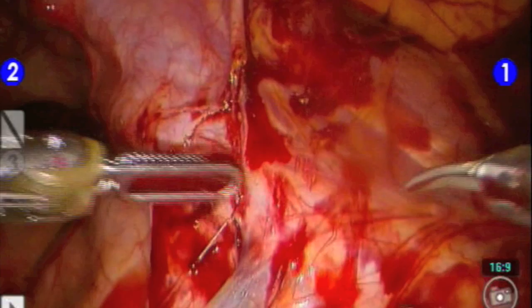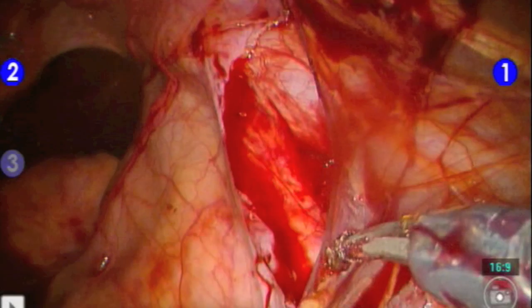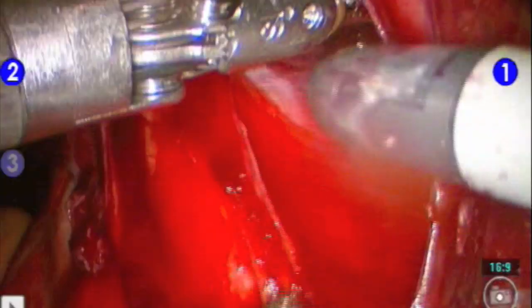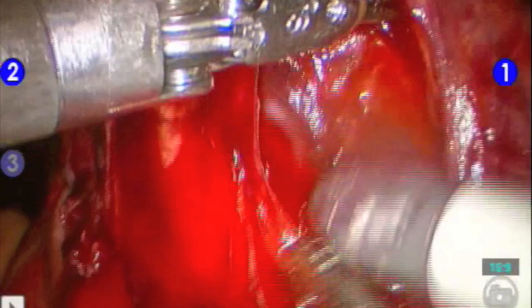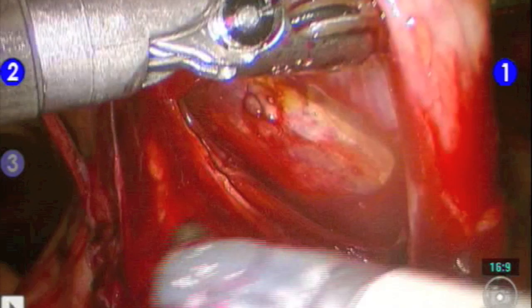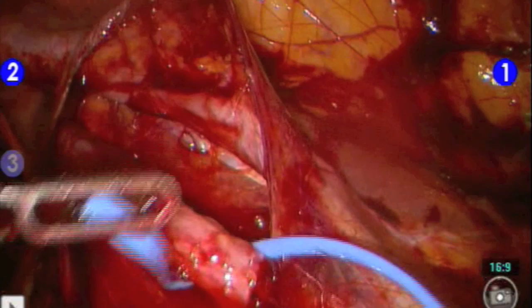The ureter is found as it crosses over the iliac vessels. A posterior peritoneal incision is made and the ureter is dissected cranially and caudally. A vessel loop is then placed posterior to the ureter to aid in traction.